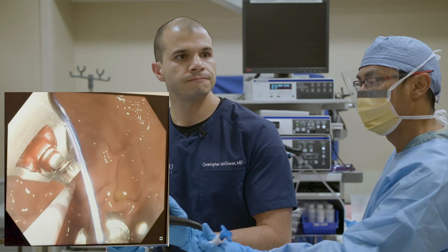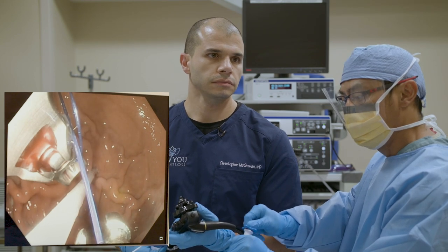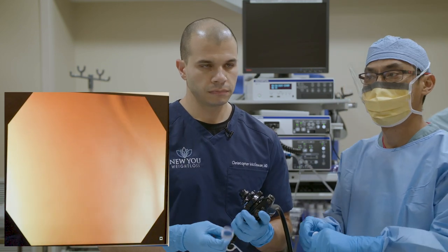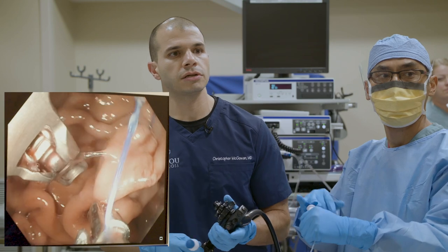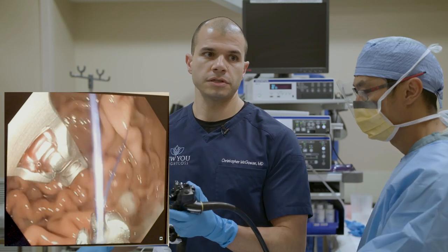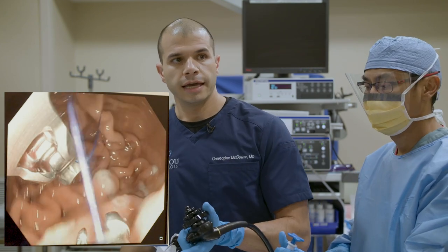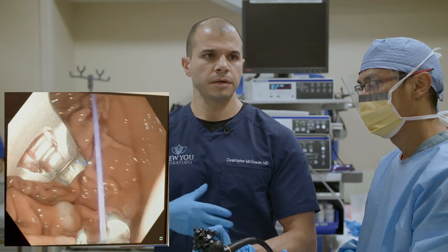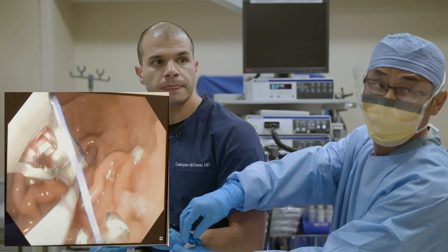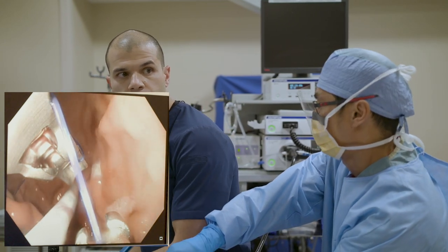We placed one stitch and you can see it entering and exiting through the stomach wall. Now we're working our way down. A question from Melissa: are there any side effects? The main side effects are in the first two days — everyone has discomfort described as gas pressure, actually from gas that gets caught around the stomach in the left upper abdomen, lasting about two days. Some people will have mild nausea and a little sore throat.